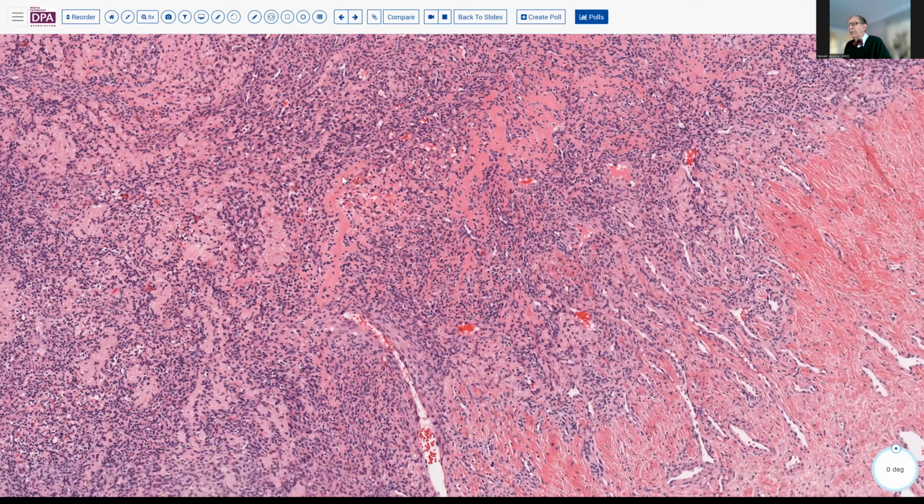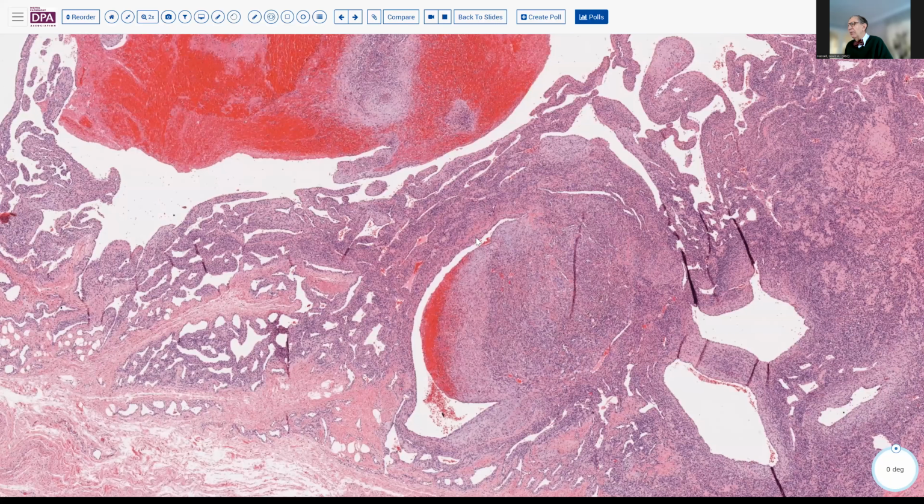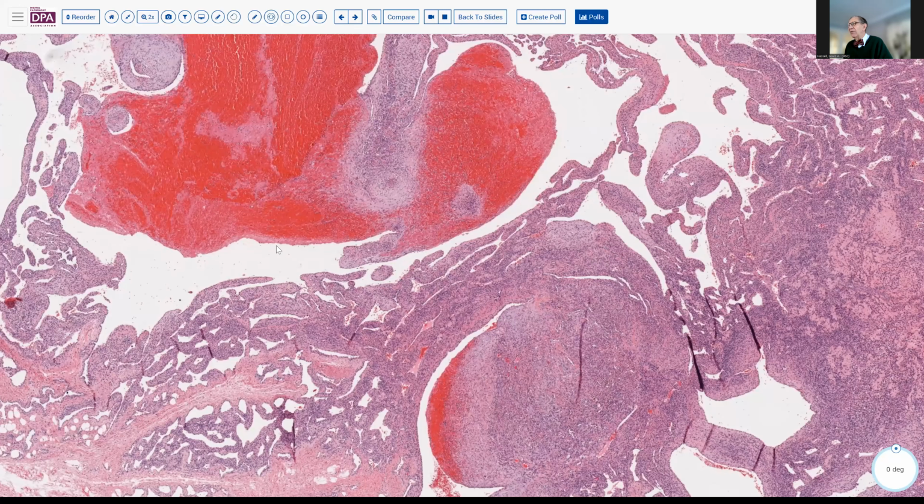It's quite unusual. It's usually present in the skin and subcutaneous tissues, most frequently in the extremities, head and neck areas, and a little bit on the trunk. As you can see, sometimes the vessels develop areas of thromboses and so forth, and so you can get this kind of backdrop of organizing thrombus as well as the primary lesion.